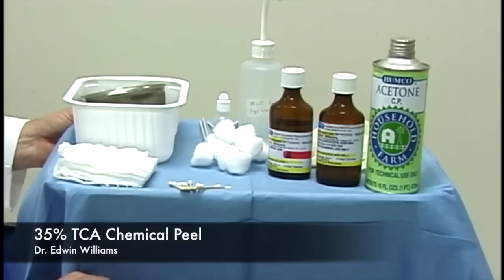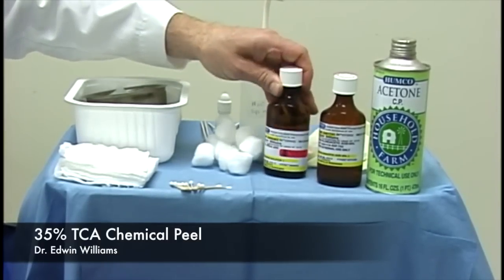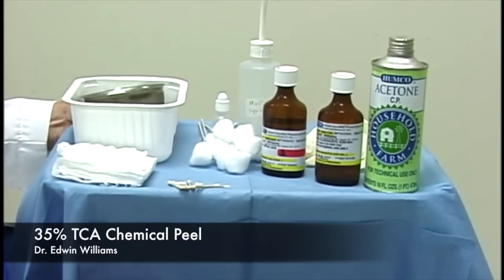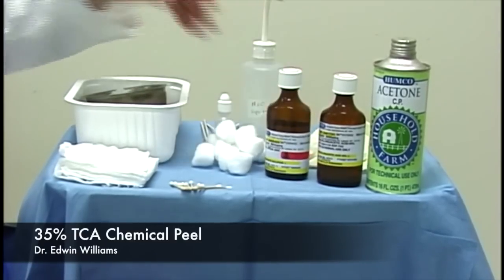Gloves are not necessary for sterility reasons, but the acetone tends to be very drying on the surgeon's hands. If you're doing these with any frequency they can become very irritated. And even though the fingers have much thicker skin, you don't want to be applying Jessner's and trichloroacetic acid on a regular basis to your hands, because you can actually inadvertently injure them.